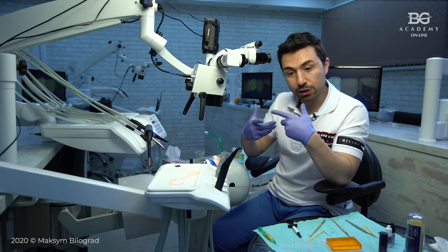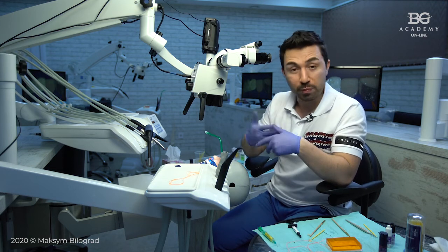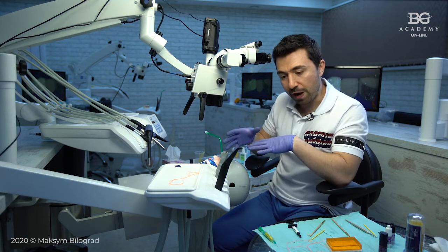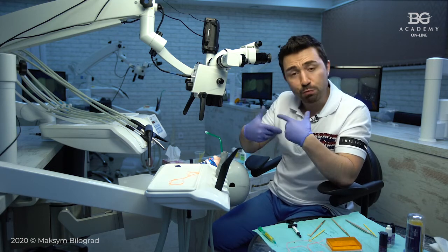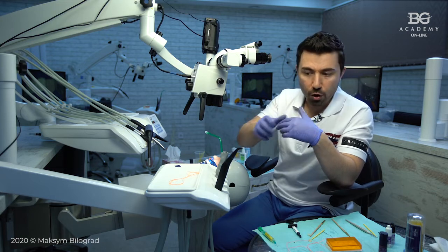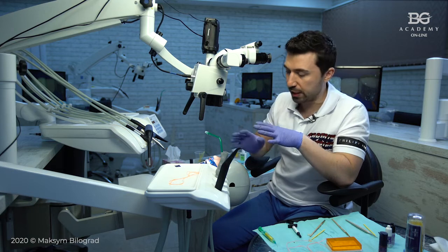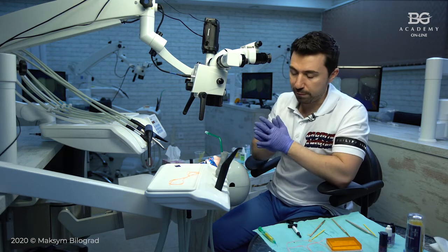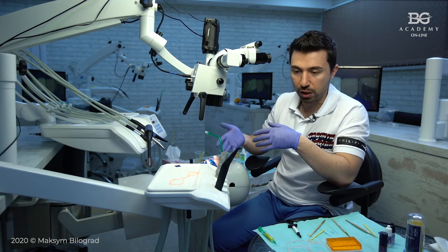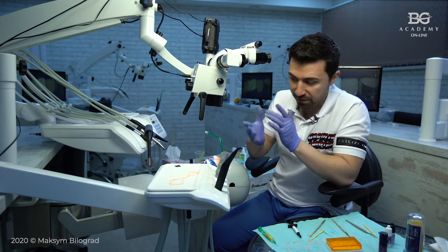So in order not to over-etch dentin, we're not counting for 15 seconds because it will be over-etching. But when we count for 5 seconds, it's still not 5 seconds, it's more than 5 seconds because the first drop was brought before and you have to stop counting once everything is rinsed out. So basically counting just for 5 means that you will have your etching gel on the dentin for maybe 10 or 12 seconds or even maybe 15.